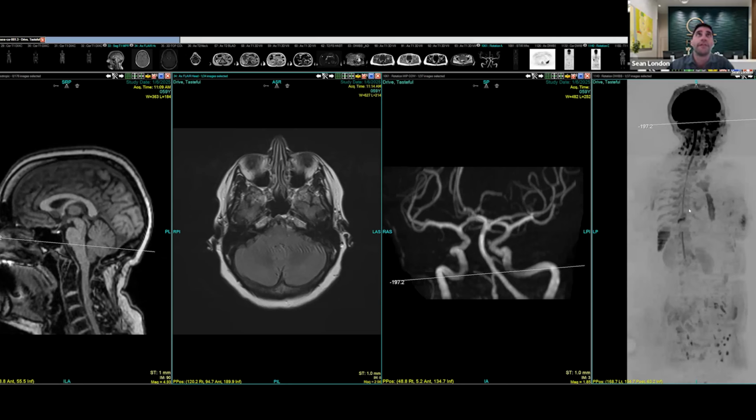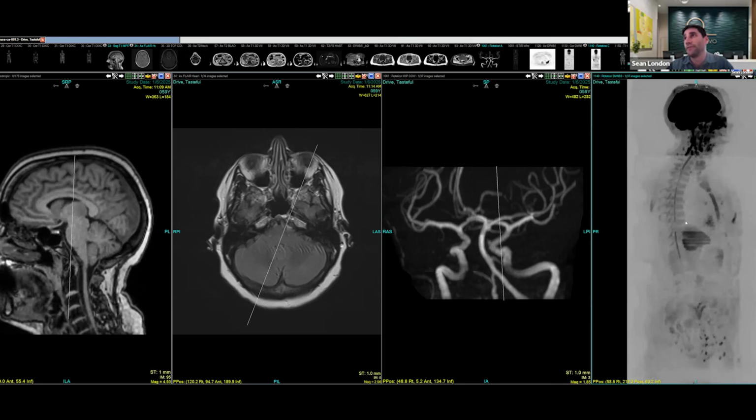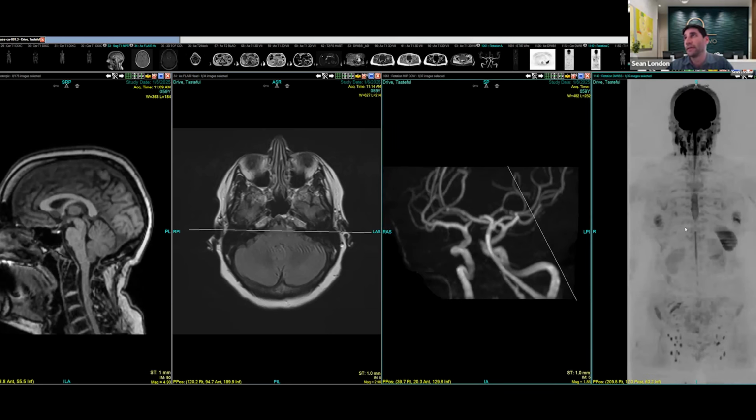And so here you can see these 4 different panels showing the brain up here. And then on this right side, this is called diffusion weighted imaging. This is one of the image sets that really sets us apart here. And it's a really valuable sequence to have, particularly in a screening setting when we don't have any contrast on board.